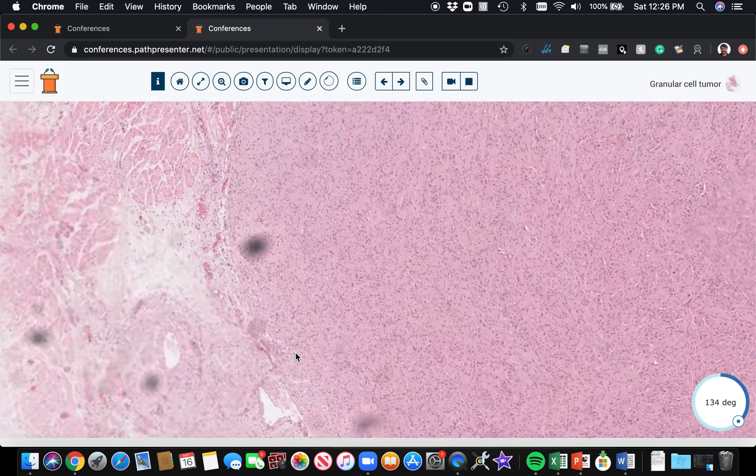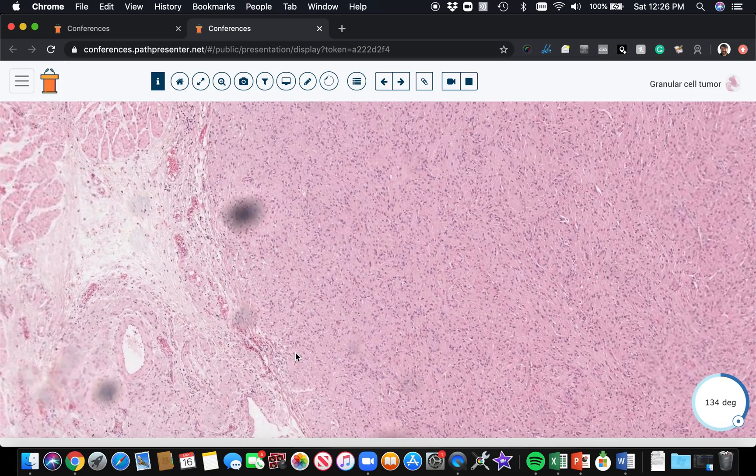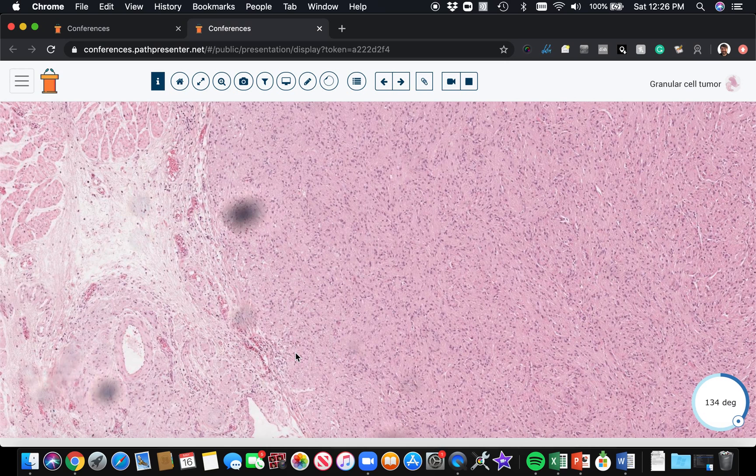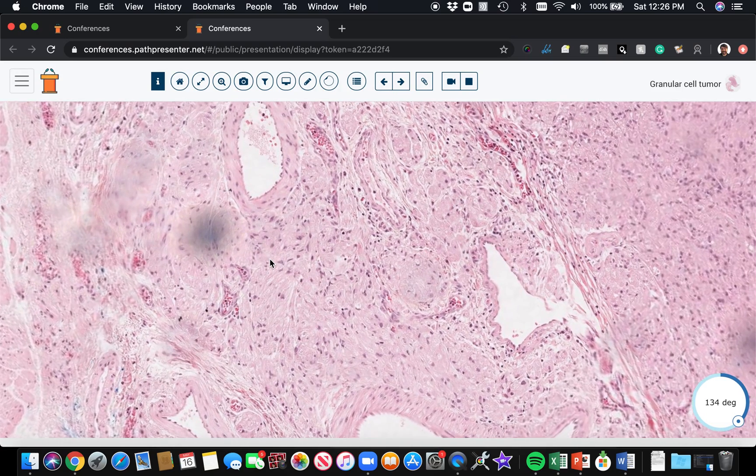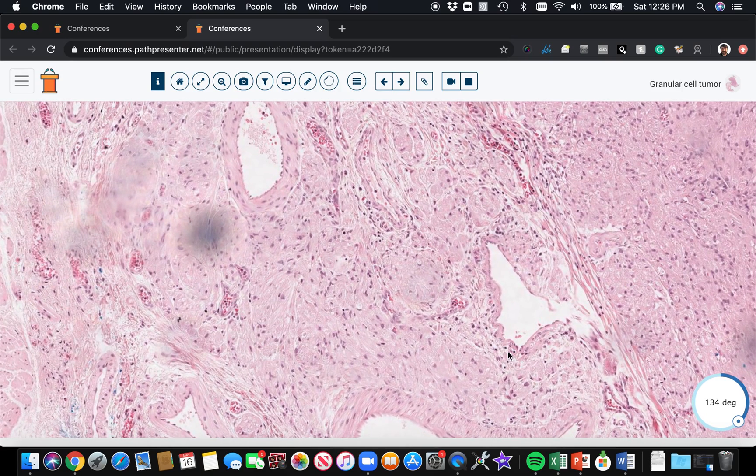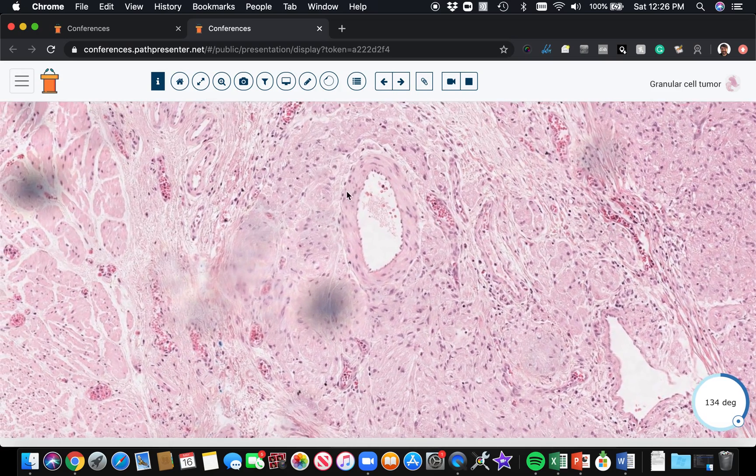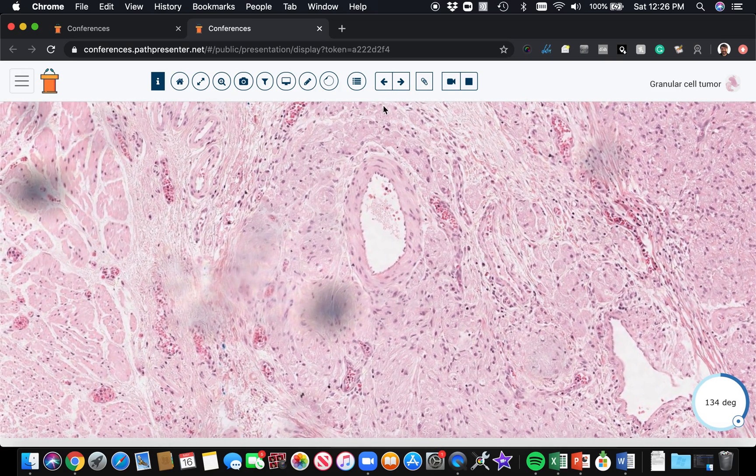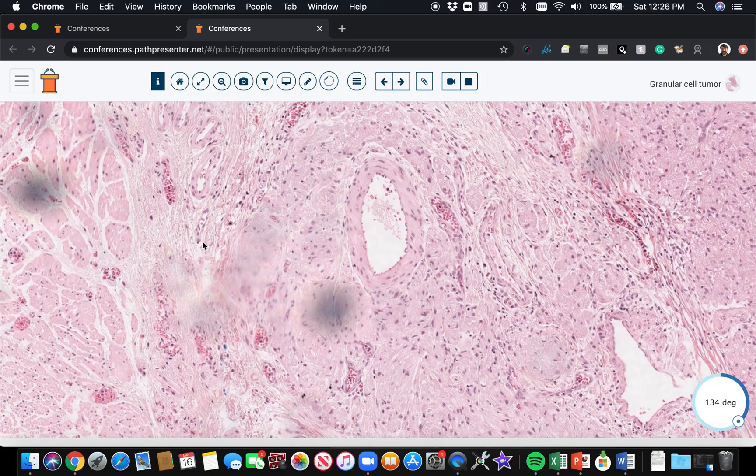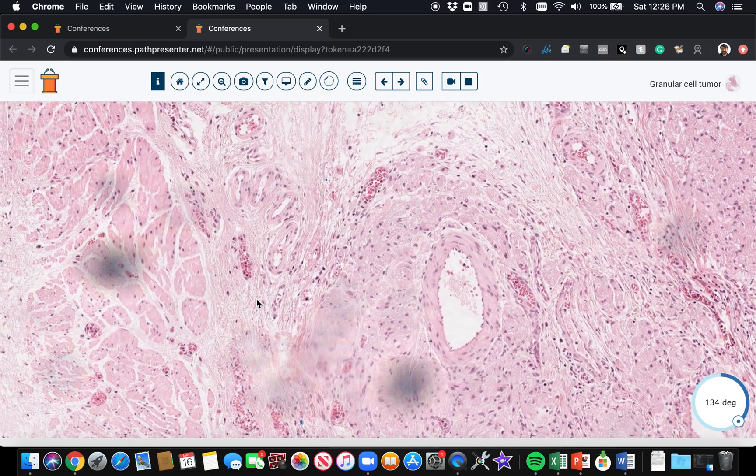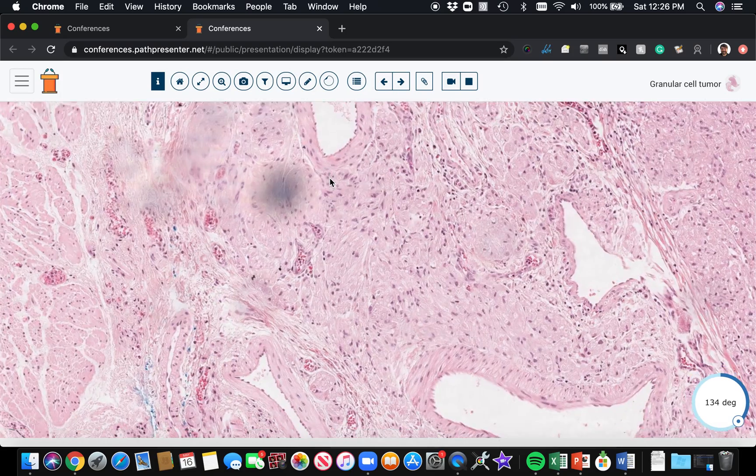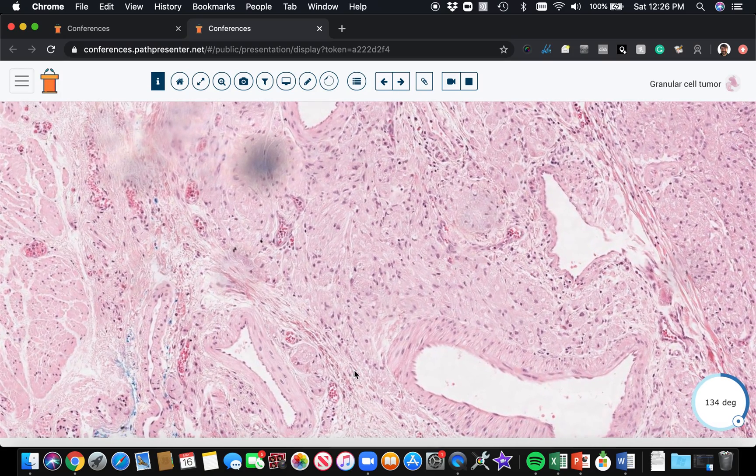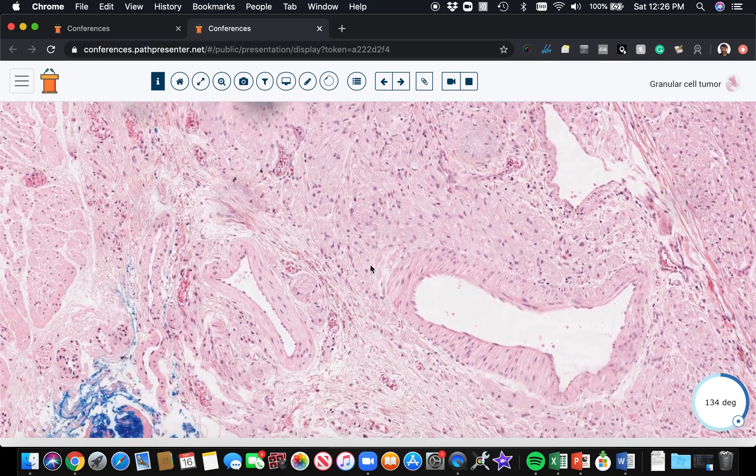The other thing I'll point out is, remember, these are nerve sheath tumors. Perineural involvement by granular cell tumor is present in like 90% of cases. Here's an example of that kind of trickling, almost infiltrative appearance of the granular cell tumor at the periphery. Totally normal, benign finding, common in granular cell tumor.